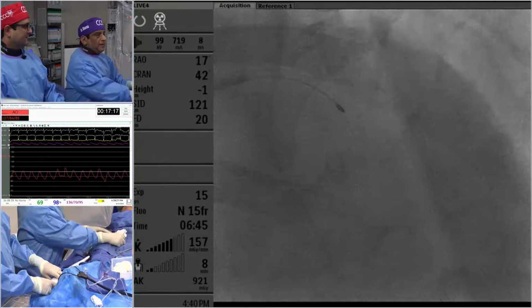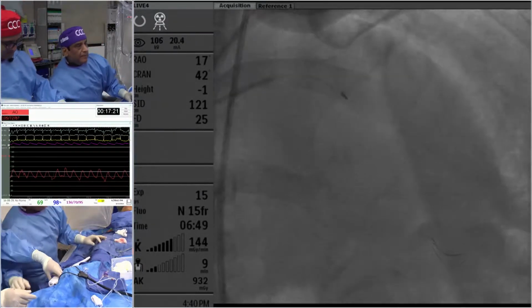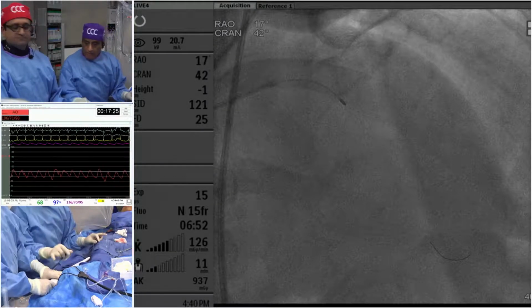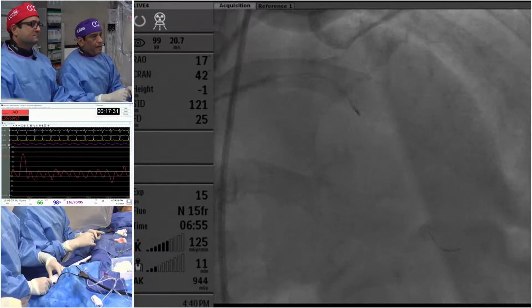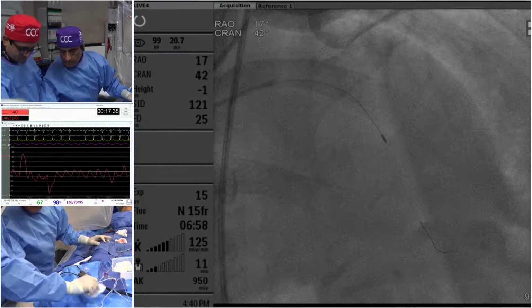We could not get the burr further down. So now we are going to go manually on the Dynaglide. We bring the advancer knob tight here, brake release, and Asad is going to pull the wire while I'm going to go on the Dynaglide. Go. Good. Fine. Nice.